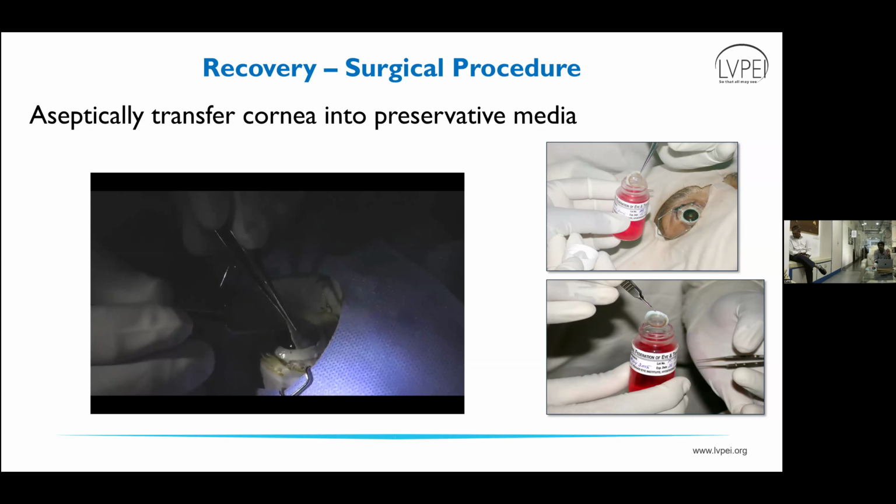If you don't keep your hand below the cornea, the cornea might fall somewhere else and get unsterile, right? So use your second hand just to hold the cornea with one forceps, and keep your other hand just below the cornea until you transfer it to the MK media.